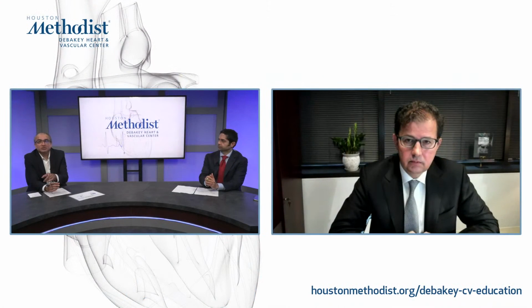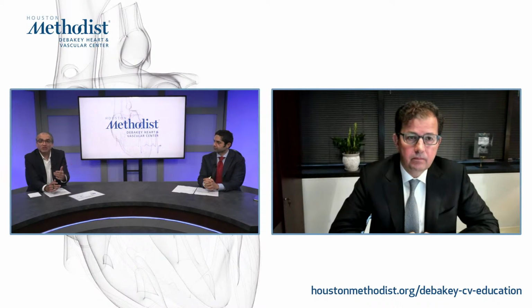So I think it's going to be a combined approach, and I think that's probably the way to go. It makes sense to do that. I don't see biopsy going away completely just because it is really the gold standard. But I think we'll probably see a new phase that we enter where we use cardiac MR a little bit more frequently. Great. Let me ask either James or Rayan to comment a little bit more on this AlloMap testing.